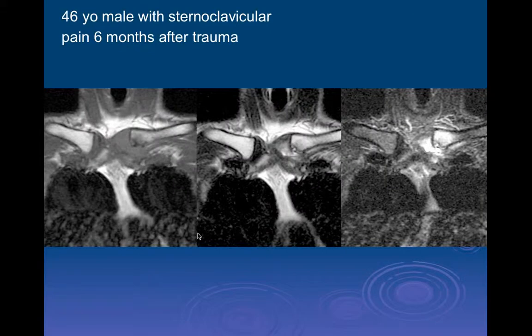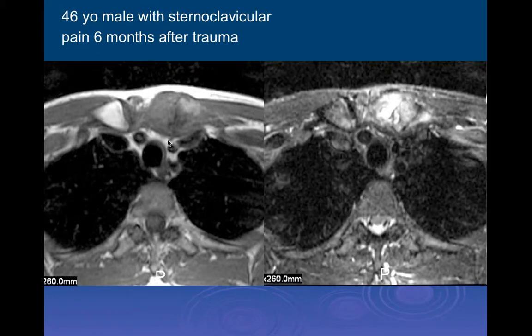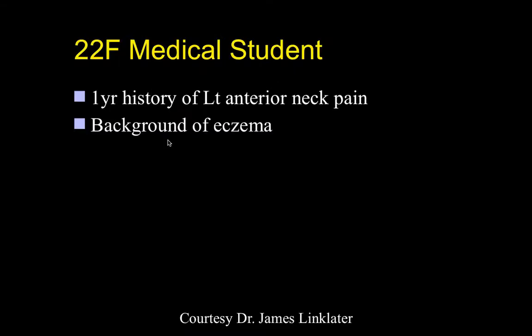Here's a 46-year-old male with sternoclavicular pain for six months after trauma. The left clavicle looks subluxed superiorly with respect to the right, with surrounding edema and a cortical defect along the inferior margin. This is at least a sternoclavicular separation with chronic instability six months post-injury. If it doesn't heal properly, you can end up with chronic instability and a chronic pain syndrome, so it's important to make the diagnosis in the acute stage and treat it properly.